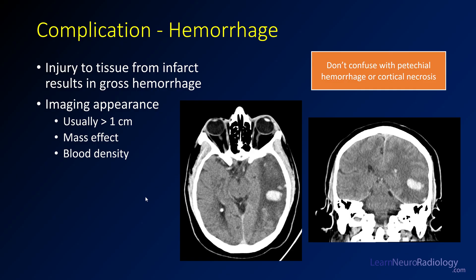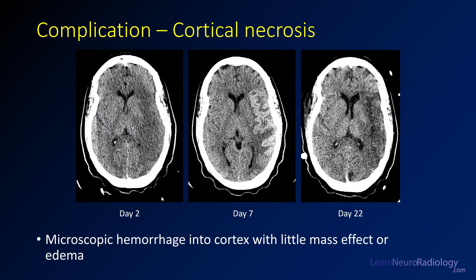Cortical necrosis is a more delayed phenomenon — that's microscopic hemorrhage into the cortex with little or no mass effect or edema. Here we have a case of a left MCA infarct on day two after presentation, with a hypodense region in the left MCA territory. By day seven, we see cortical gyroform hyperattenuation has developed following the cortex, but with very little mass effect. This is what cortical necrosis looks like — some call it cortical laminar necrosis, though that's more of a pathologic determination. By three weeks, that cortical necrosis has washed out, leaving a volume-negative area of encephalomalacia in the left MCA territory. Most of the time, these patients do not have to stop anticoagulation.